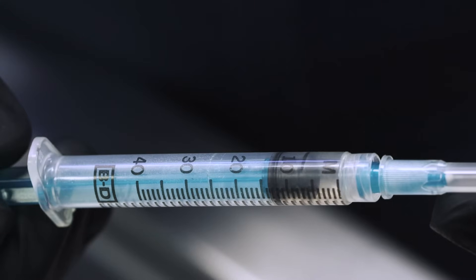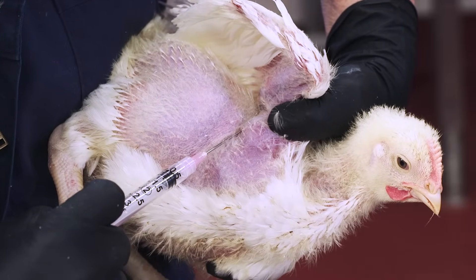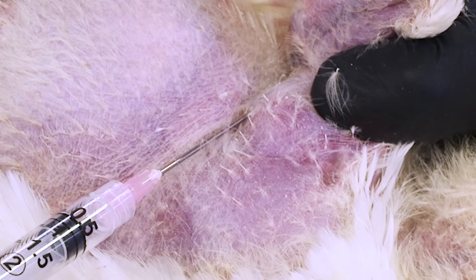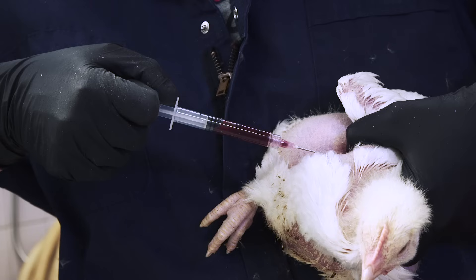To take the sample, first withdraw the plunger slightly to break the seal, creating a small vacuum inside the syringe. Hold the needle along the brachial vein, pointing towards the top of the wing. The angle of the needle should be almost parallel to the skin. Since avian veins tend to have very little connective tissue support, they can slip around easily beneath the skin. Plan to insert the needle either directly over the vein or slightly to the side, with the bevel of the needle facing up. Try not to insert the needle right on top of a feather follicle, as they are very sensitive. Insert the needle slowly into the vein. Because of the slight vacuum previously created, a small amount of blood should enter the syringe on its own. When done, withdraw the needle while simultaneously applying pressure to the puncture site.